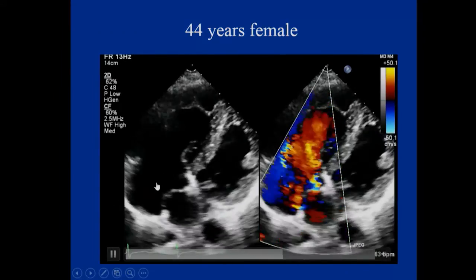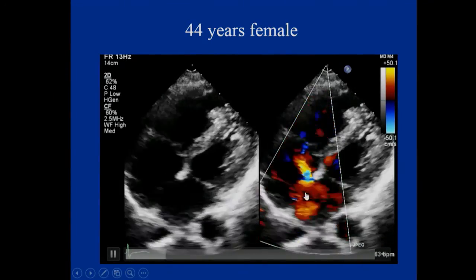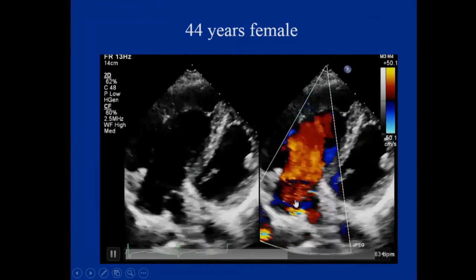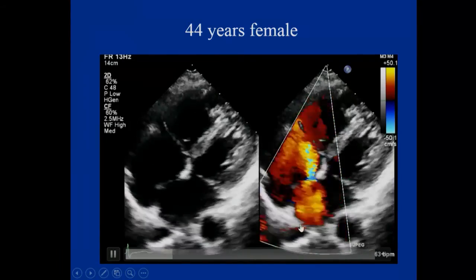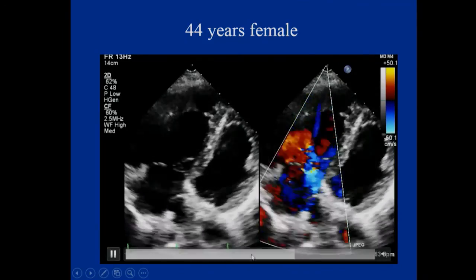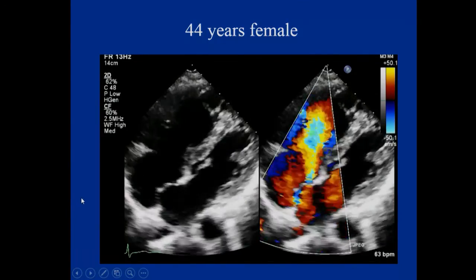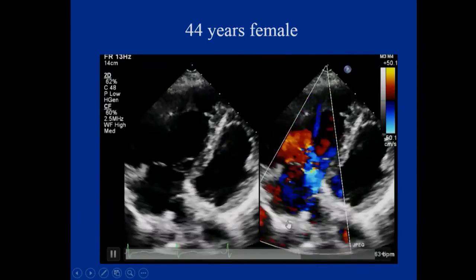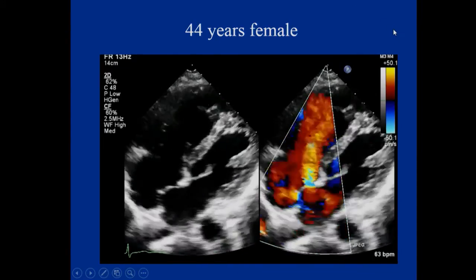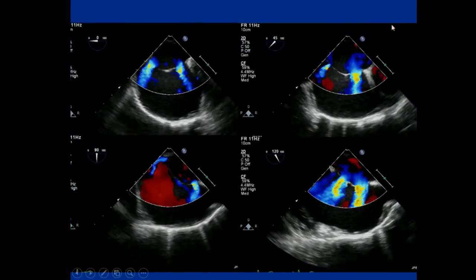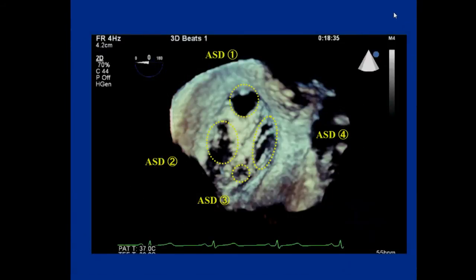In complicated cases, septal aneurysms with more than two shunts can be visualized by transesophageal echocardiography, and aneurysmal formation is also available. However, anatomical evaluation is still very difficult. On 2D TEE it appeared to show two or possibly three defects; even with color Doppler two-dimensional echocardiography there is difficulty visualizing multiple defects accurately.